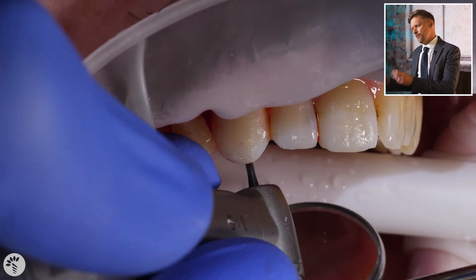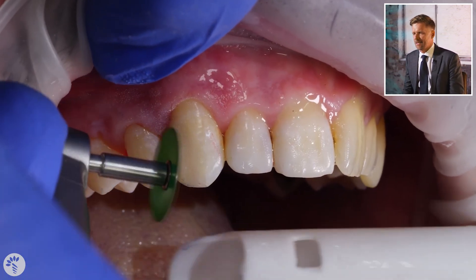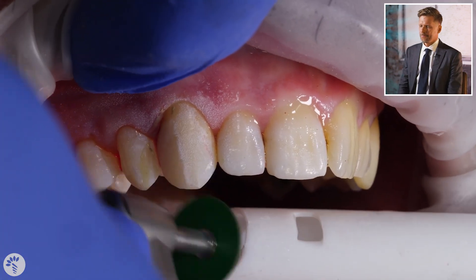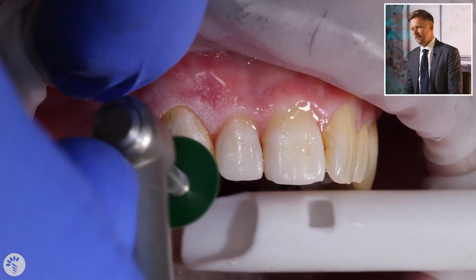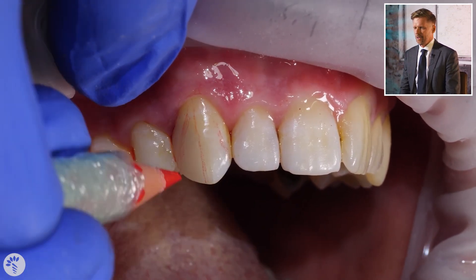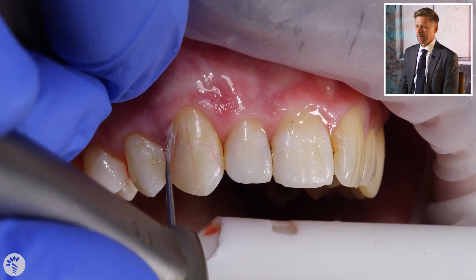You'll notice there's a methodical approach here: first get the occlusion right, then get all of the gingival margin right, not bothering with aesthetics until that's done — buccal, lingual everywhere. Now I'm working on the shapes, getting the embrasure nice and deep because that's what makes the tooth look like a tooth, and getting the incisal edge shape right. Mostly doing this with a coarse disc, then putting in lines as a guideline so you don't lose your bearings. Now using a very narrow-tipped diamond bur to get into the proximal without hitting the adjacent tooth.